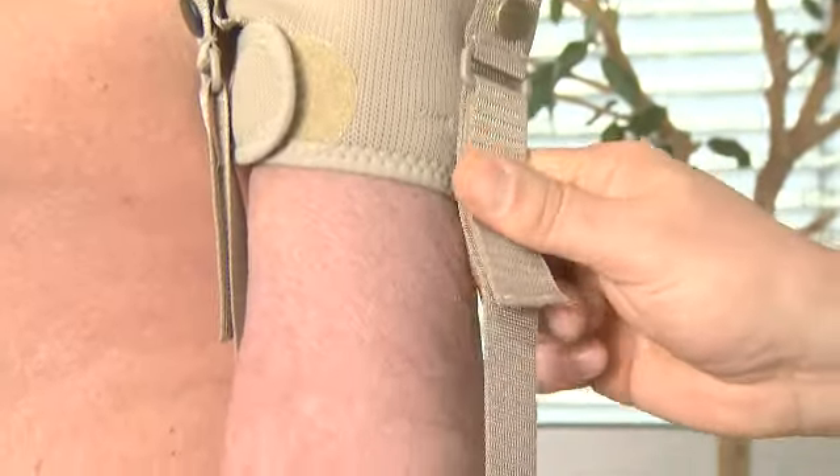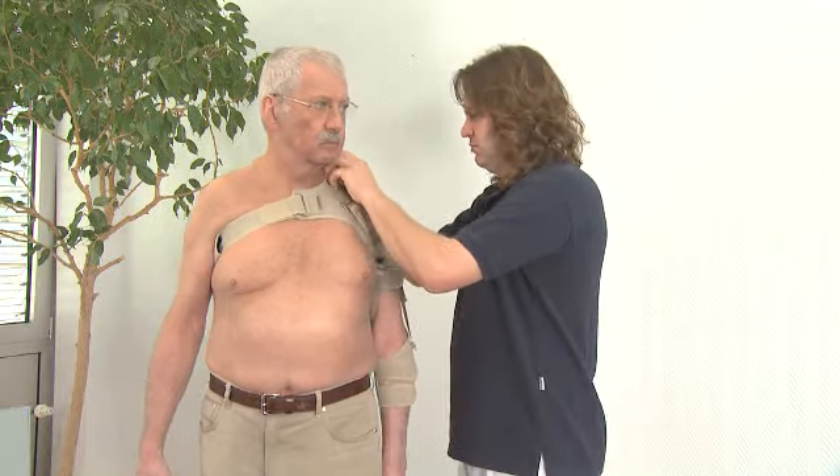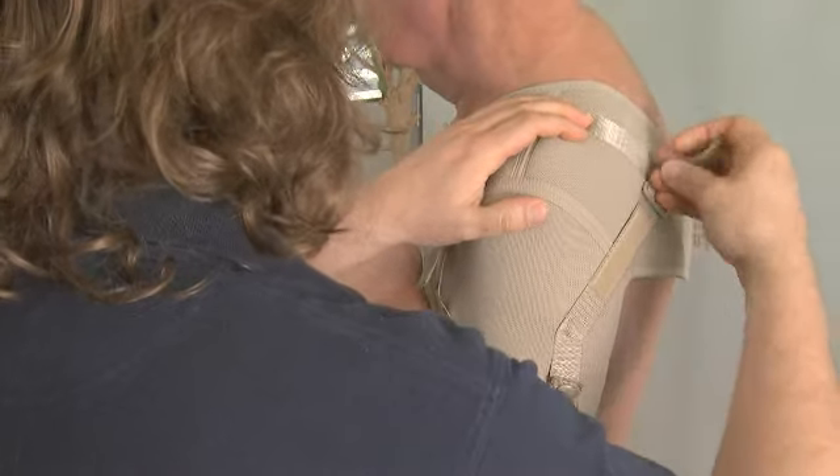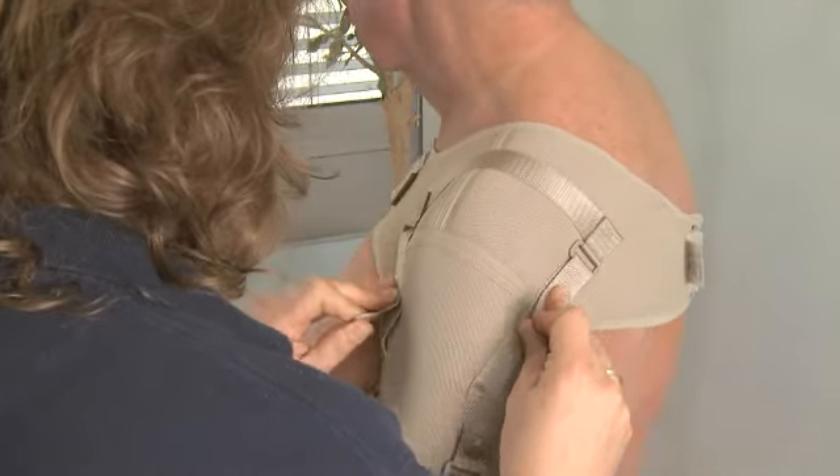Adjust the two straps on the upper part to lift up the upper arm in a correct position. If necessary, correct the product for perfect fitting.